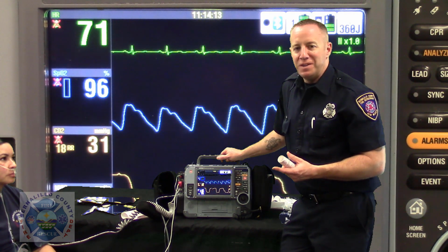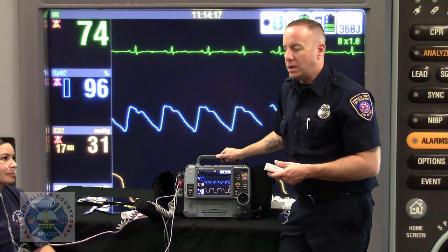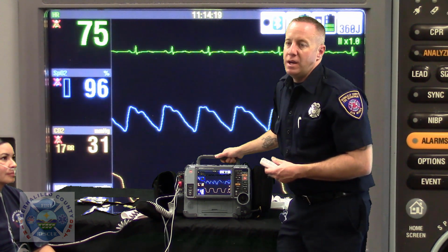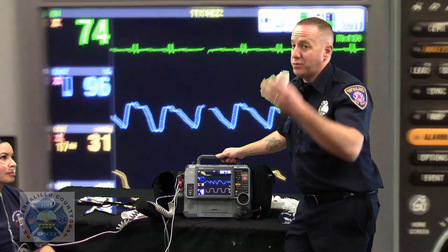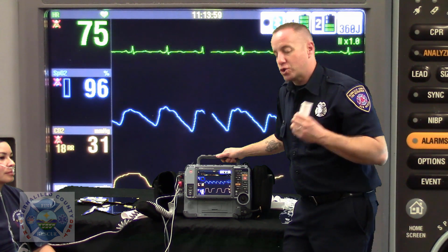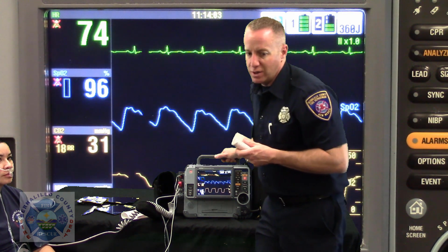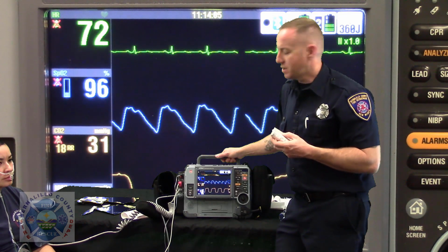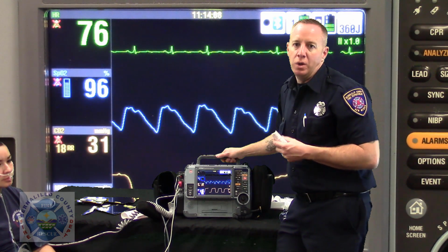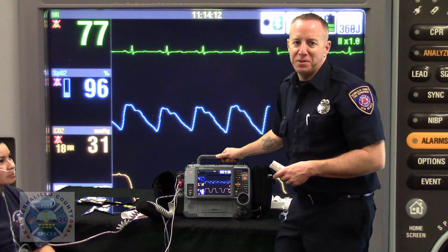Soon, this monitor, once you power it off, is going to auto sync all of these up into the cloud, and all of this data will be available for you to pull down into the new charting software, ImageTrend, and it'll shorten the amount of time it takes you to do data entry for your charting. So you're going to be at the computer a lot less time after these calls, and getting back to studying up on the other features of the LifePack with all your newfound downtime.